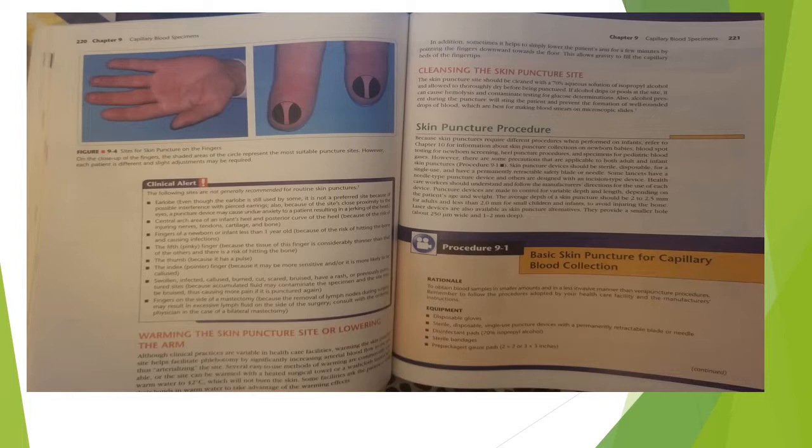Clinical alert. The following sites are not generally recommended for routine skin punctures. The earlobe. Even though the earlobe is still used by some, it is not a preferred site because of the possible interference with pierced earrings, also because of the site's close proximity to the eyes. A puncture device may cause undue anxiety to a patient, resulting in a jerking of the head.